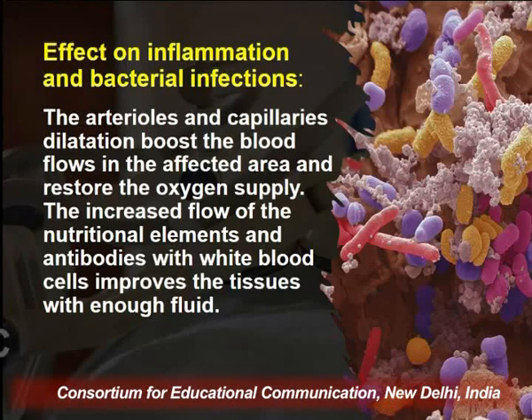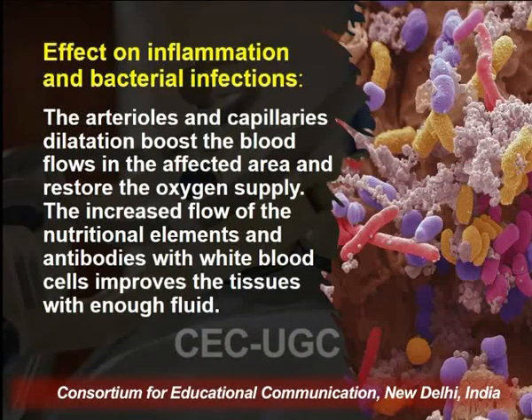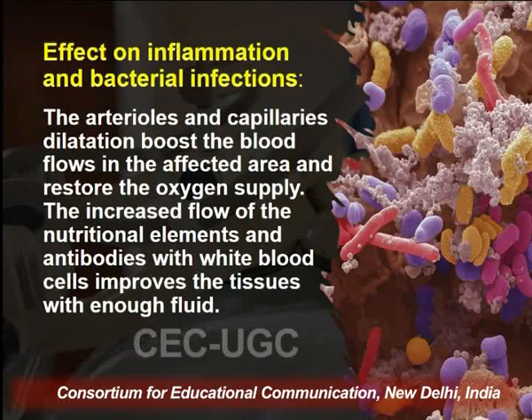So, the first effect is effect on inflammation and bacterial infections. So, the arterioles and capillaries dilate and boost the blood flow in the affected area and restore the oxygen supply.